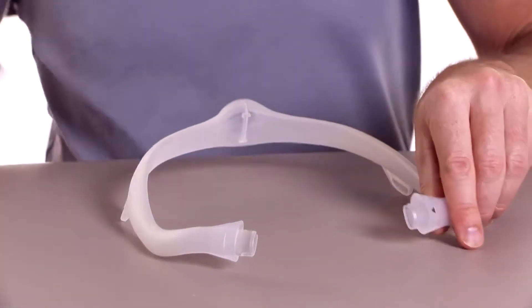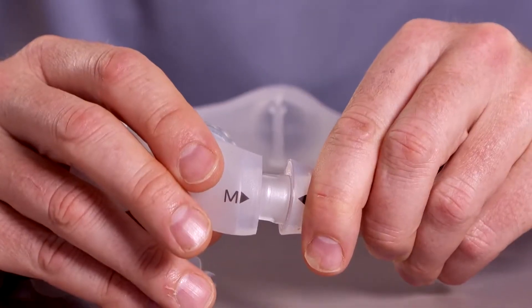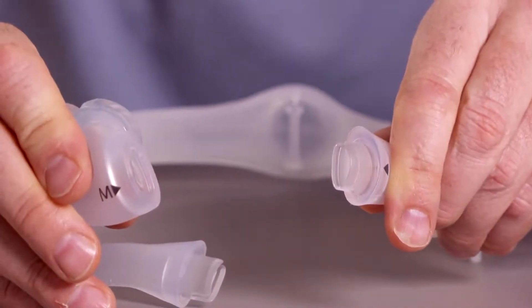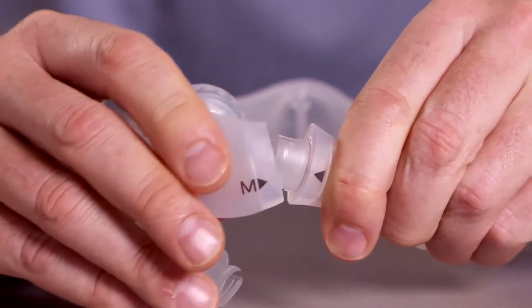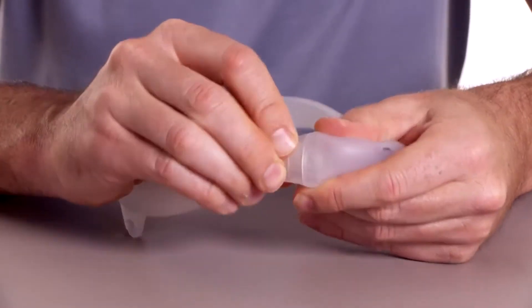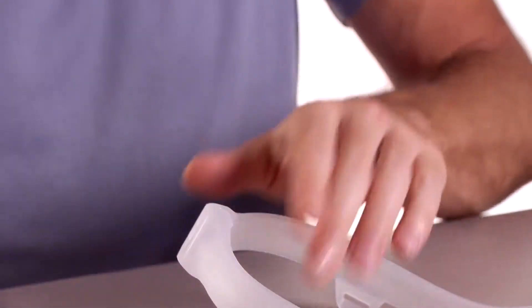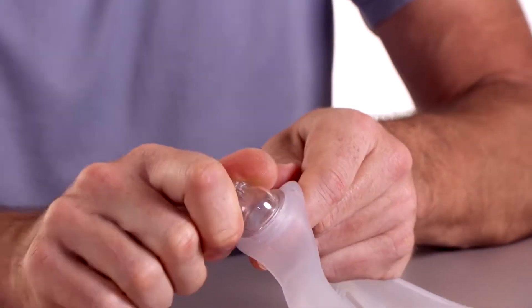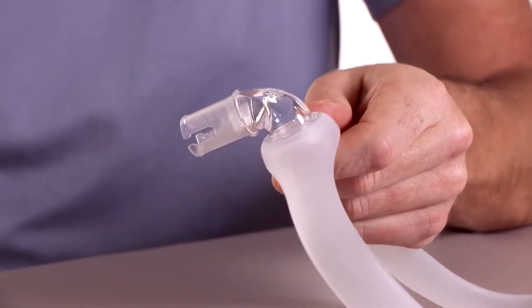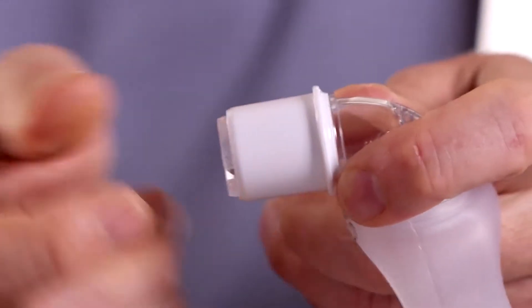To reassemble the Dreamwear mask, align the triangles on the cushion and frame. Notice that the cushion and frame opening have a similar shape. Press the mask cushion into the frame until it clicks into place. Insert the elbow into the top of the mask frame, then push the tubing quick release onto the elbow — you should hear it click into place.